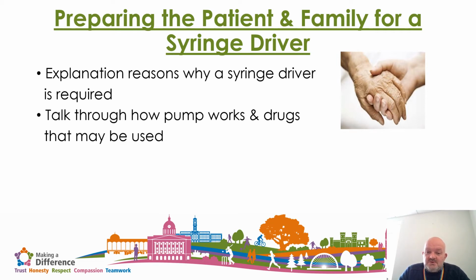We are also going to talk about how the pump works. The patient and family don't need to know how the pump works, in that they're not going to be asked to do anything with the pump. But what they do need to know is that if the pump alarms, they need to know what number to ring to get somebody to go round and deal with the situation.